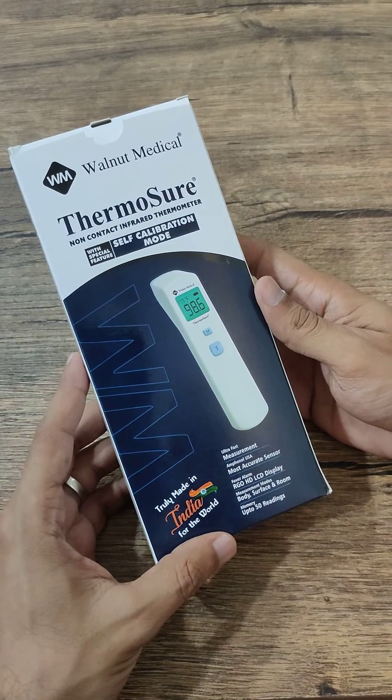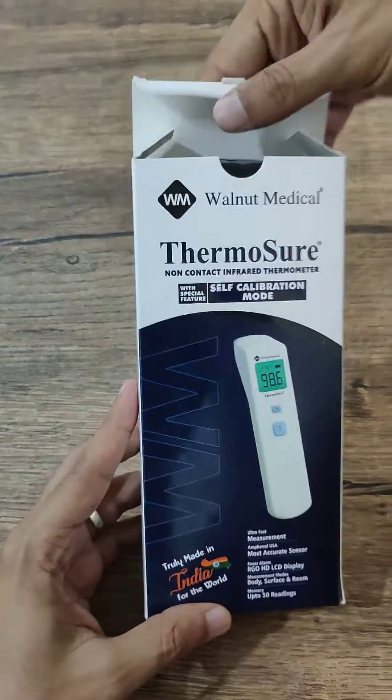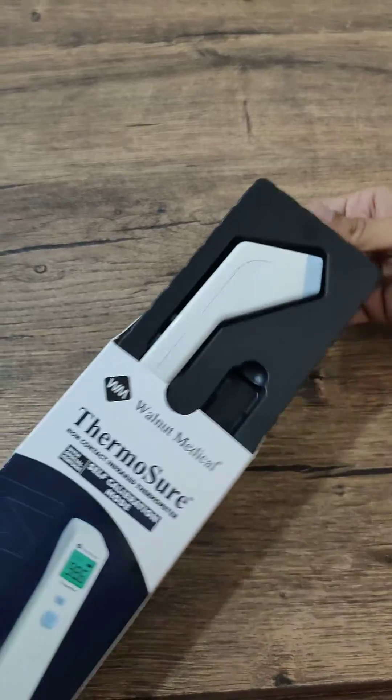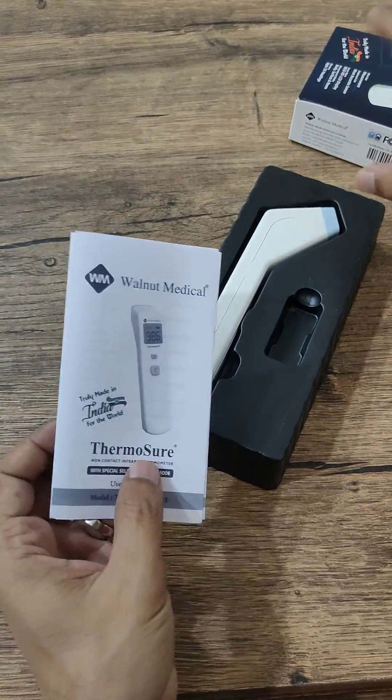This is the unboxing video of the new Thermoshore, which comes with a self-calibration mode. When we open it, we get the Thermoshore along with its manual.